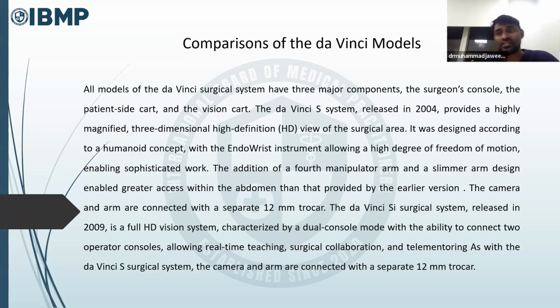So, comparisons of the Da Vinci models. We only operate Da Vinci; others are Ugoras and SSI Mantra. In India, these two are famous, Da Vinci and SSI Mantra. So today we'll be discussing the comparison of Da Vinci models and SSI Mantra.